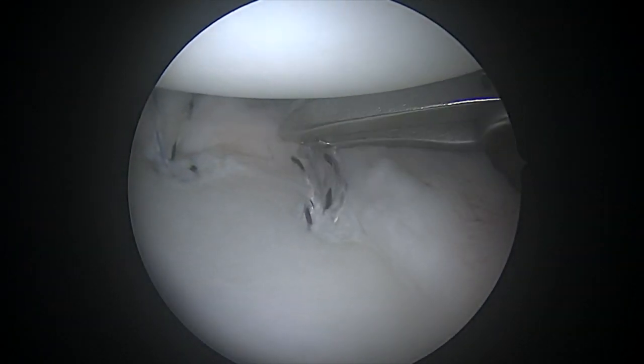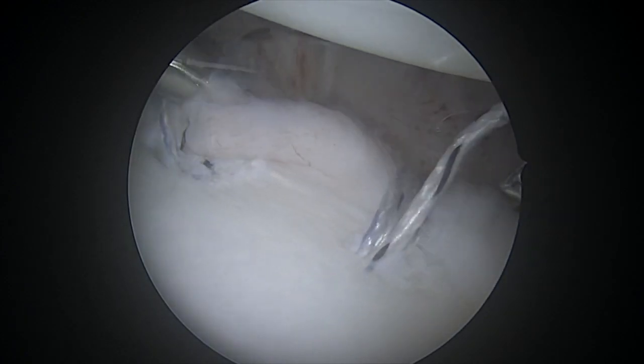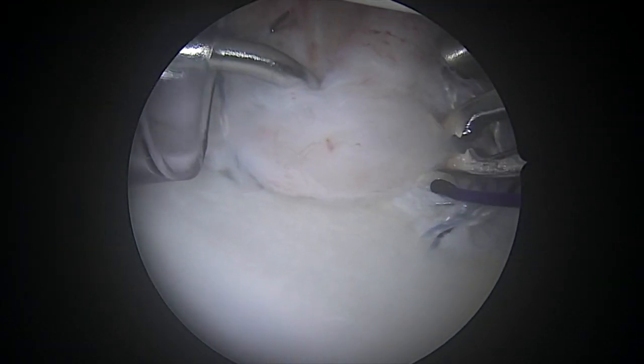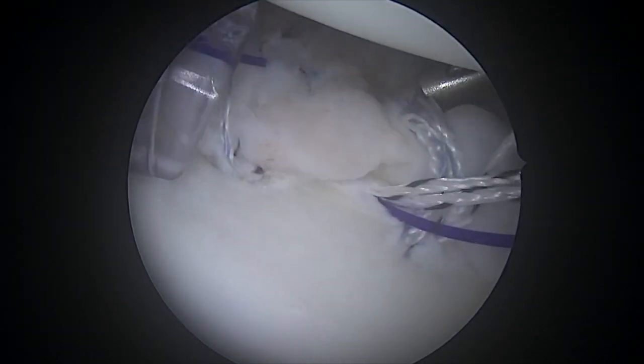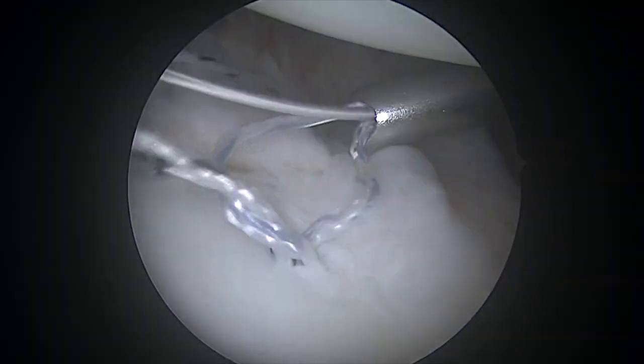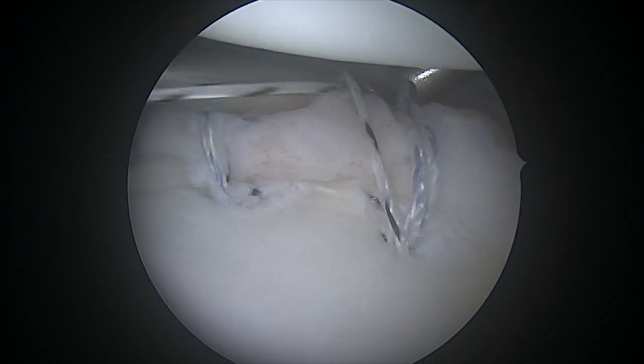I like that position here. We'll do the same process where we grasp our sutures one at a time. Once we've gotten the sutures grasped and pulled out, we can come in with that curved needle. One of the things I want to show here is that we work really hard to make sure the sutures are perfectly placed. We'll tie this down, and you can see how that creates even more of a nice bumper in the front of the shoulder.